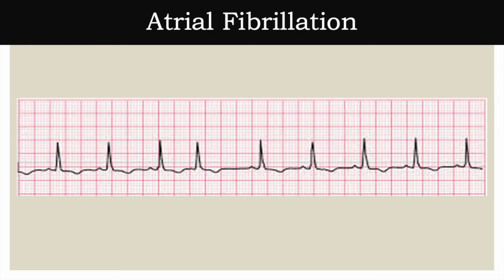Figure number 2. This is going to be Billy. So Billy is in the hospital, and he has a history of Afib. Okay, Billy is good. He's stable. His vitals are good. He's not complaining of any signs and symptoms. No chest pain, no shortness of breath, no palpitations. But he has a history of Afib.